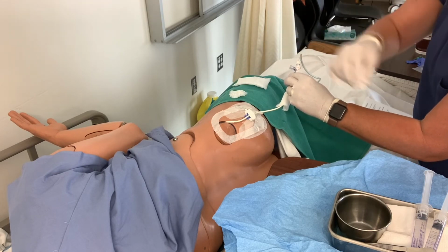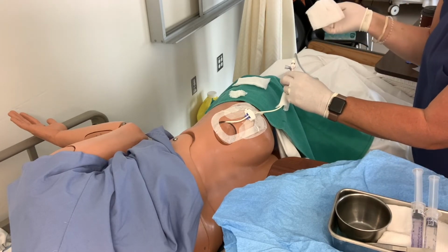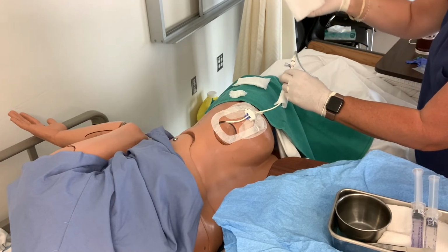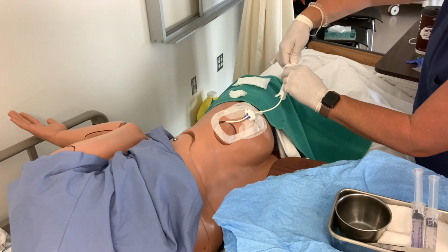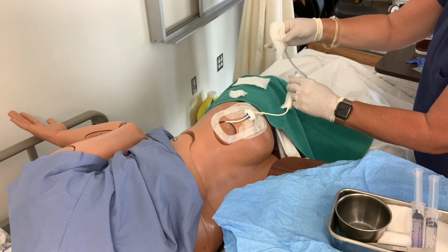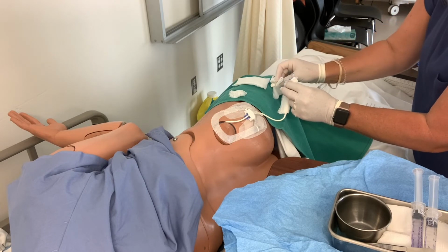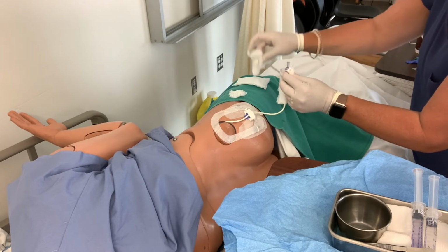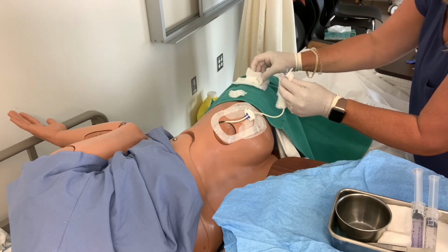Now I'm going to disconnect this one. The key is just remember, don't ever touch the tube. You've got to think of it like a hot potato. You just don't ever touch it. So using the gauze, you're going to take off the tubing. So I'm kind of moving my hand down so that you can see where I disconnected the tubing, okay? So I'm kind of up against white stuff here. It's hard to see. And I'm going to set that tubing on sterile gauze.